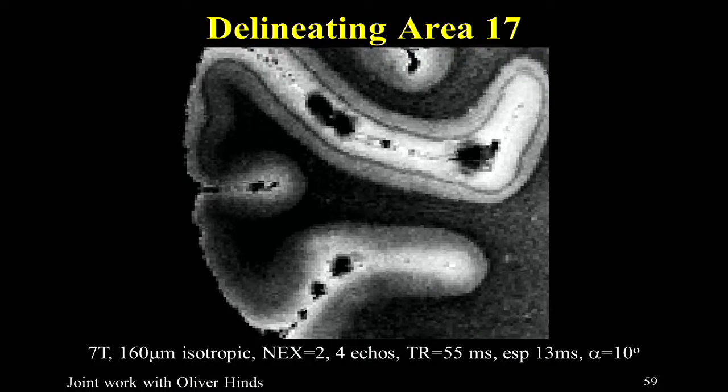So instead, what we've been doing is scanning ex vivo. When we scan ex vivo, we get about a factor of 1,000 in SNR. We have specially built small coils, in collaboration with Larry Wald, that we put right on the sample. There's no skull in the way.